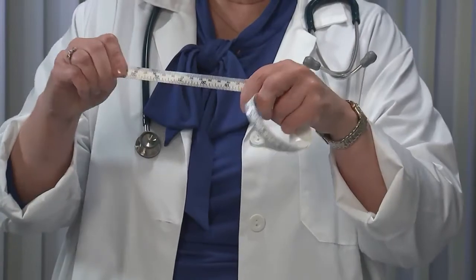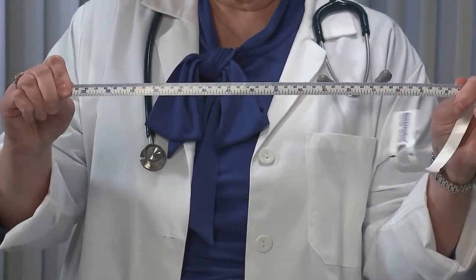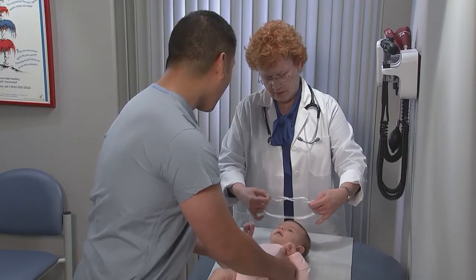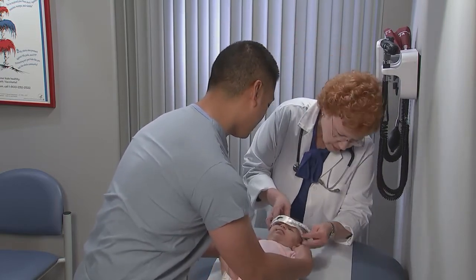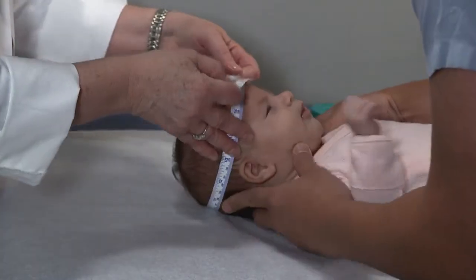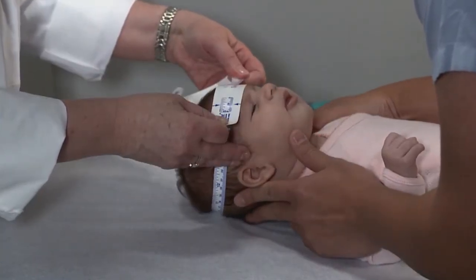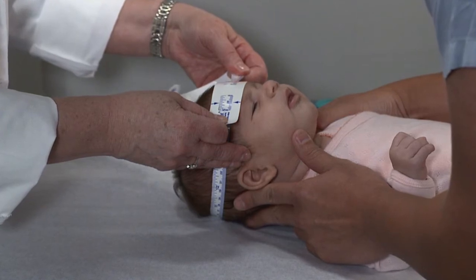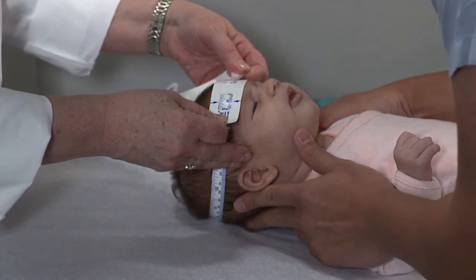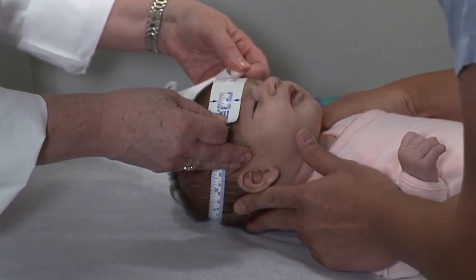Measuring head circumference isn't always as simple as it sounds. Let's review important considerations and methods now. First, start with a measuring tape that cannot be stretched. Next, securely wrap the tape around the widest possible circumference of the head — that's usually one to two finger widths above the eyebrow on the forehead and then across the most prominent part of the back of the head, as you can see here.